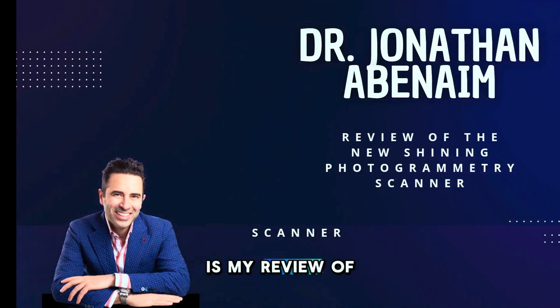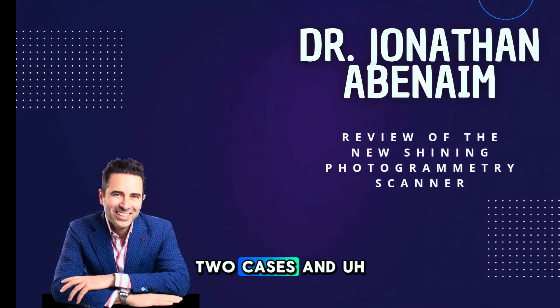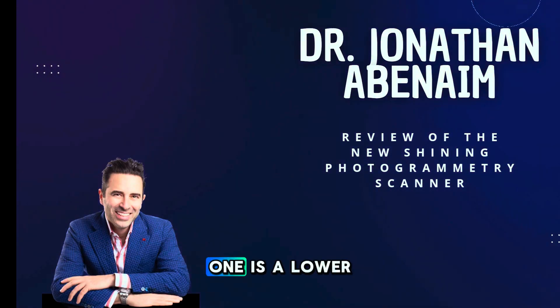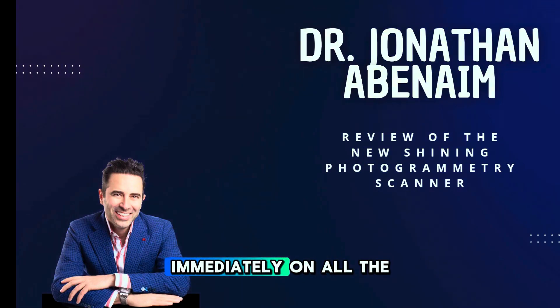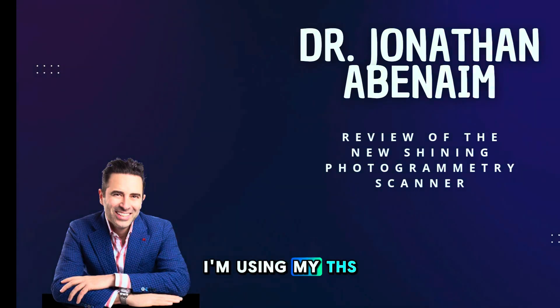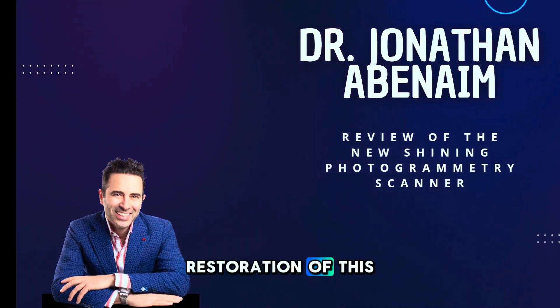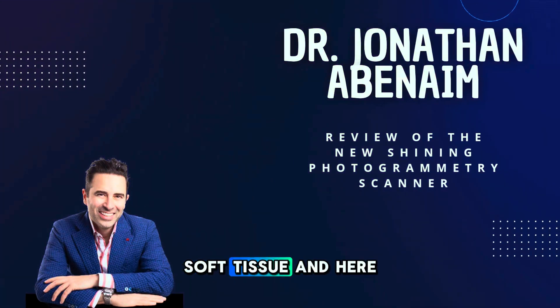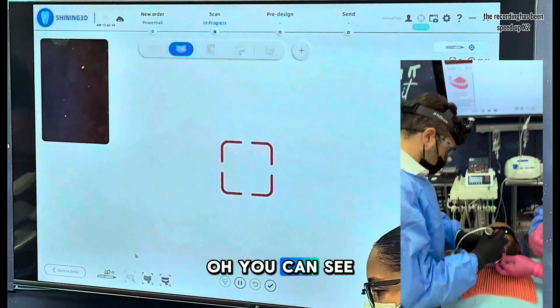Here is my review of the Shining scanner. There are going to be two cases: one is a lower arch where I removed failing implants and placed some new ones, and scanned immediately. On all the cases I'm using my THS caps for the restoration and the soft tissue scan. Here we're using the Shining scanner, so here we go.